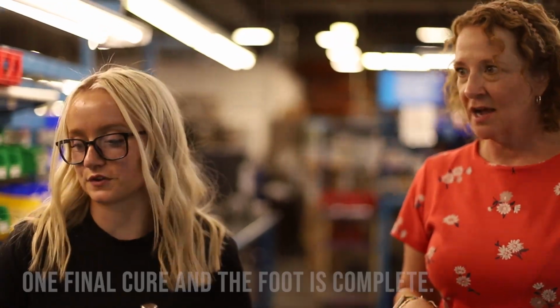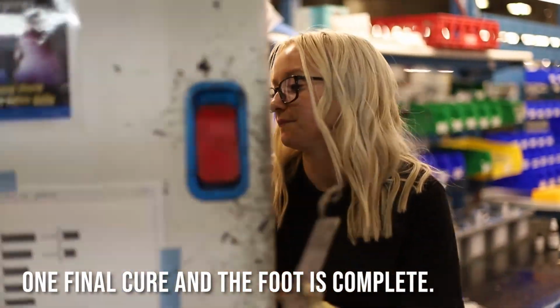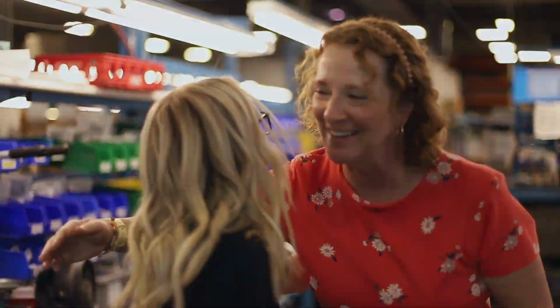And then once it's cured, how long is it cured for? About 10 minutes. And then once it's done, it's ready to go? It's close to ready. We'll do some final inspections. We'll maybe put some stickers on it. And do the packaging process. That's super cool. Thank you.